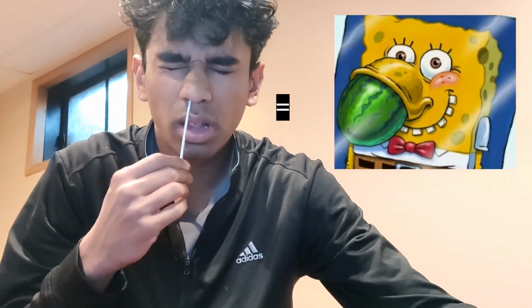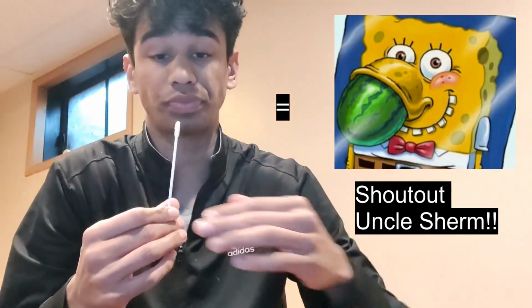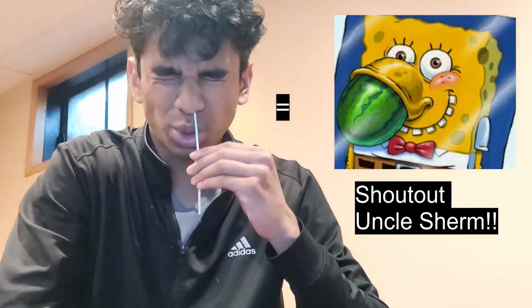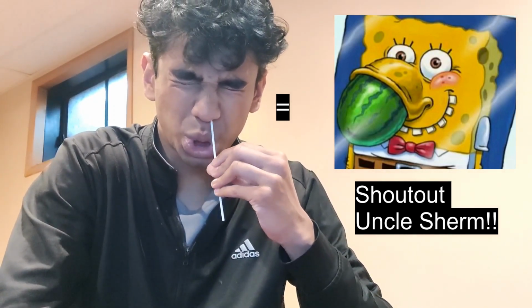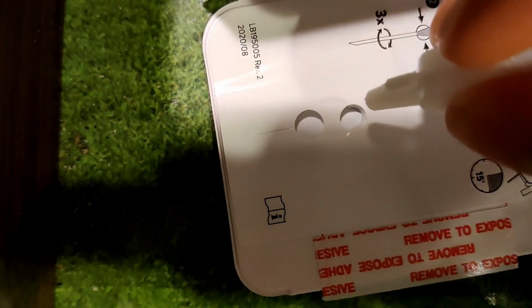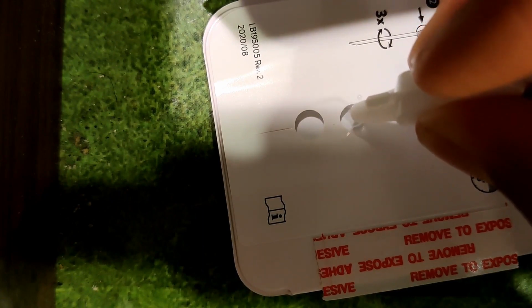When you first take the swab of your nostril, the swab is collecting a sample of mucus from your nasal cavity, which tends to be a very likely spot for the virus to be present if you're infected with it, because COVID-19 is known for infecting the respiratory tract. Now you really got to swirl it around in both nostrils to ensure that you get a sufficient amount of sample so that if there is a virus present, there's a better chance of it being detected by the test kit. Then, you have to open up the test card and squirt several drops of the extraction reagent into the sample well.